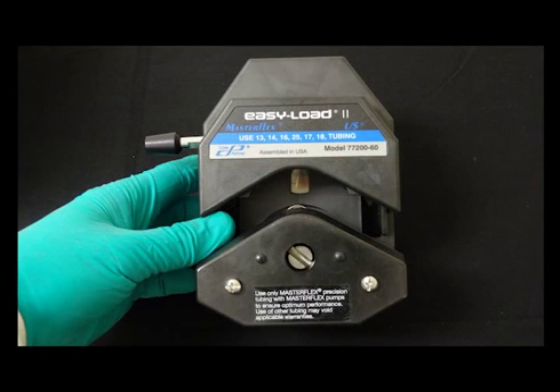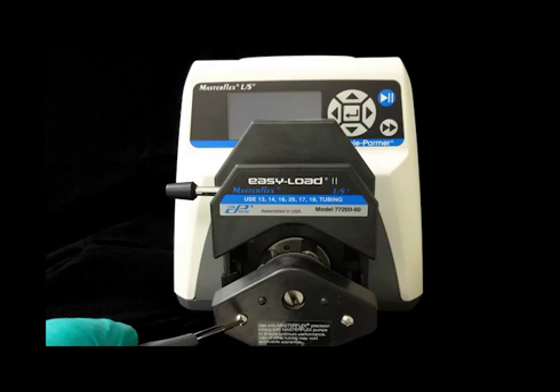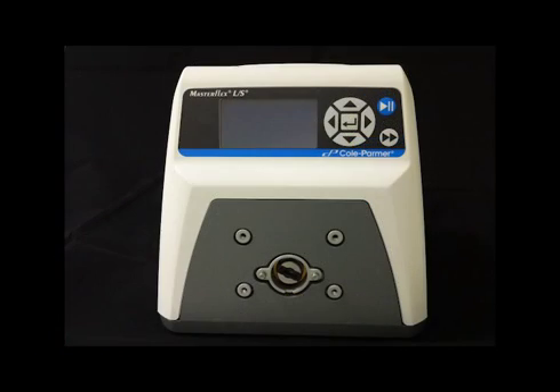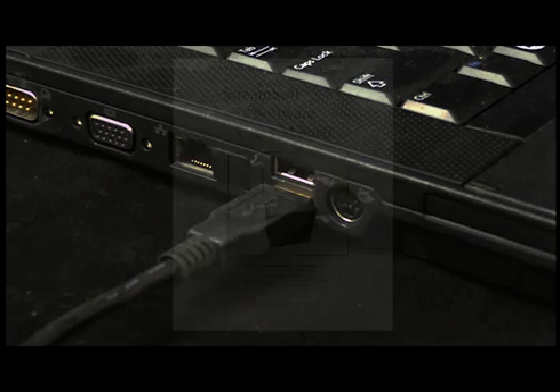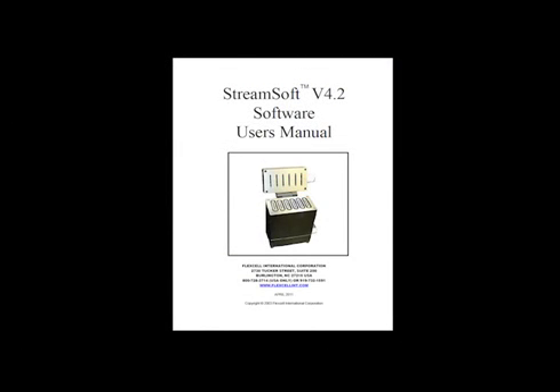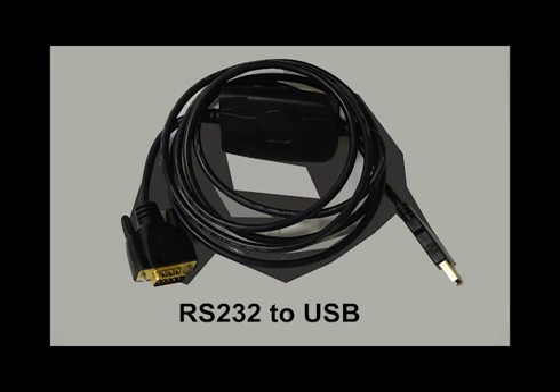Before setting up your system, please ensure that the pump head of the MasterFlex peristaltic pump is attached to the pump body. Also, prior to connecting the devices to your computer, please install the Flex-L Streamsoft software and the RS232 to USB driver using the respective included disk.